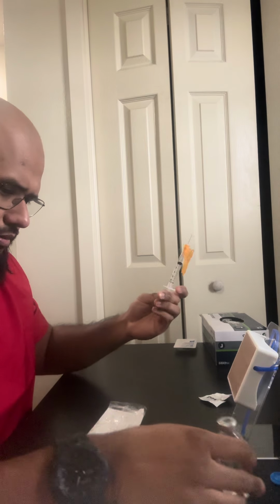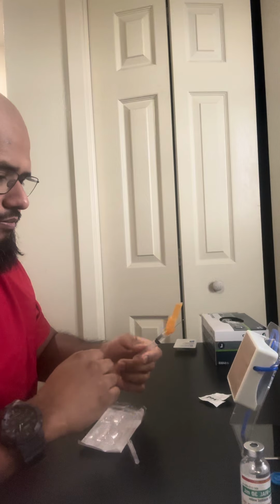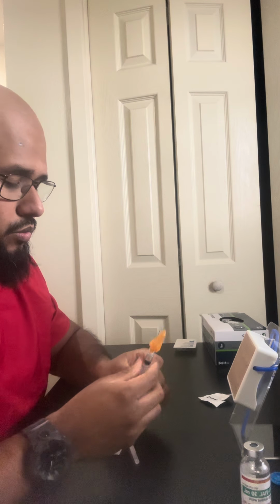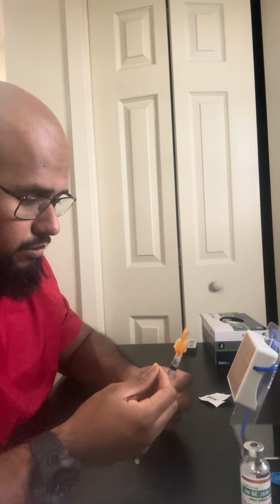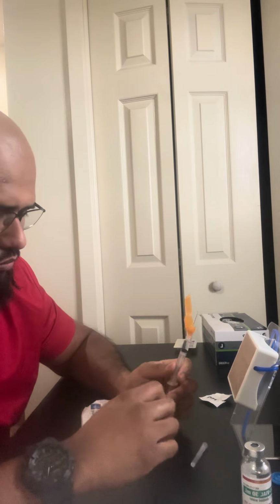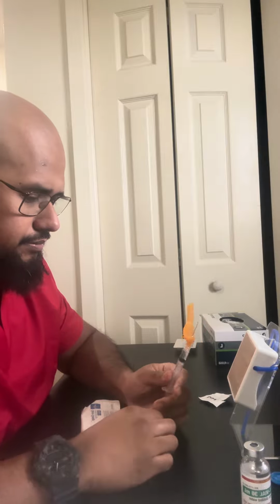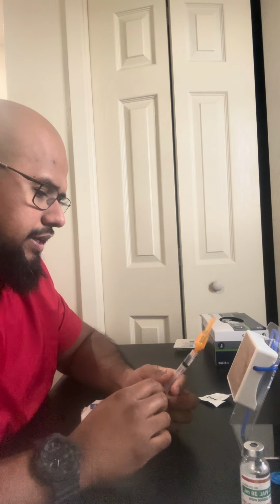Okay. Once you've got the 0.5 mL, you would, of course, remove the blunt needle and then put on your 25 gauge by 1 inch. All right, Mr. Jones, I've got your IM injection ready.